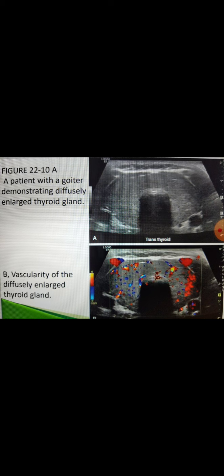They can be isoechoic, hyperechoic, and complex cystic due to fibrosis or focal scarring, ischemia, cystic degeneration or calcification formation. So there is a variety of sonographic findings that we can assess while evaluating a thyroid for nodular thyroid disease.